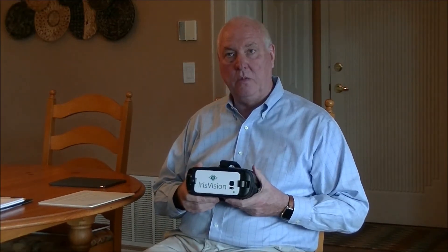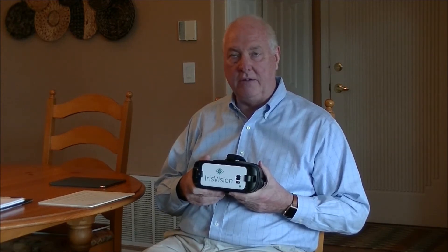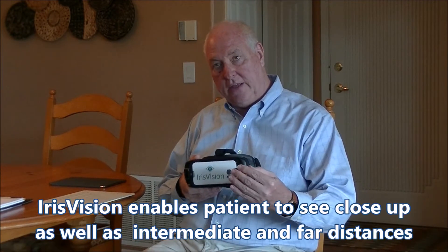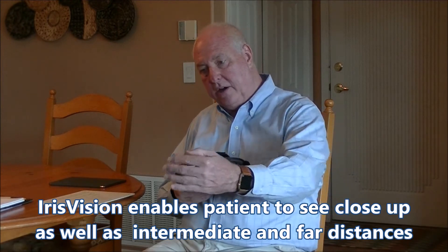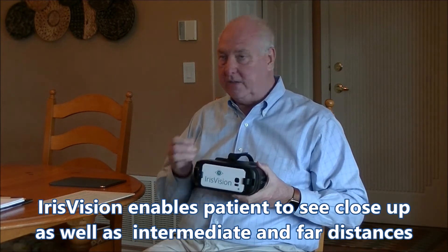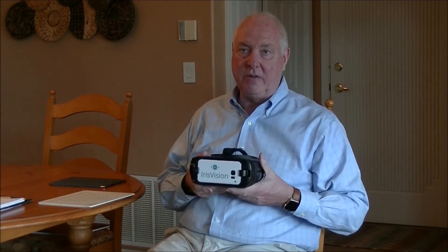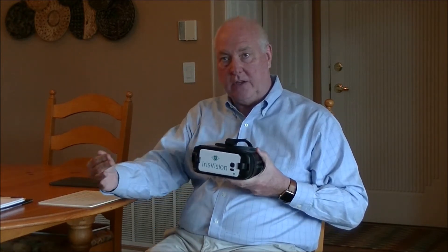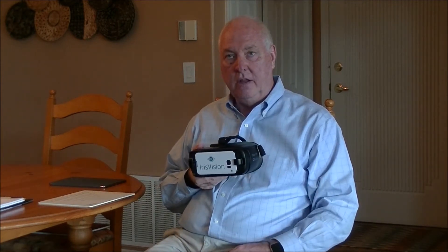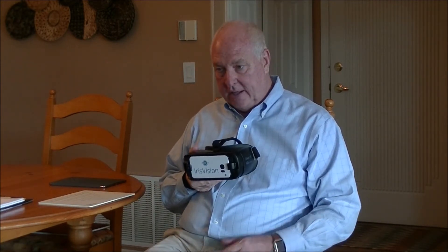Many people ask: what is the best thing that you can do with the Iris Vision? Well, it's very versatile. It's being able to see things close up, at intermediate distances, and at far distances. One of the things that's difficult in low vision is those intermediate distances, as there's very little magnification that can be done farther away from your eyes.